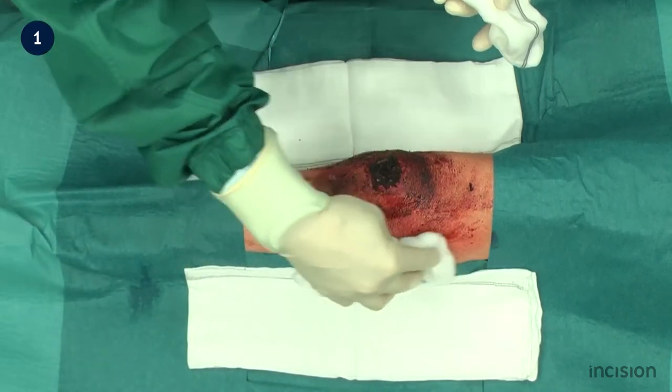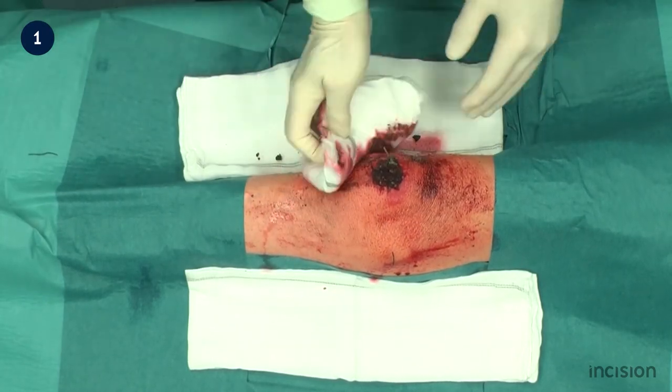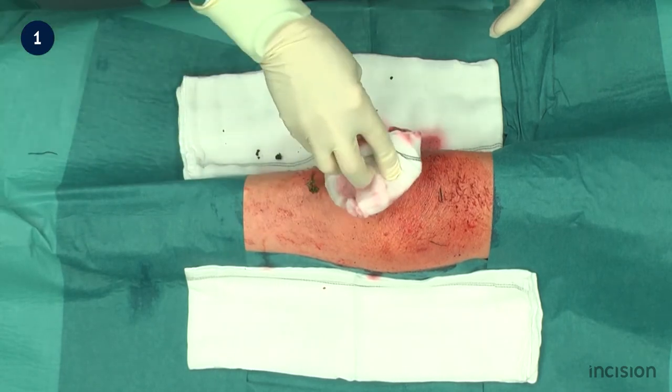Cleaning should ideally be performed starting at the centre of the wound and moving outwards towards the perimeter. This is not the technique demonstrated in this film.